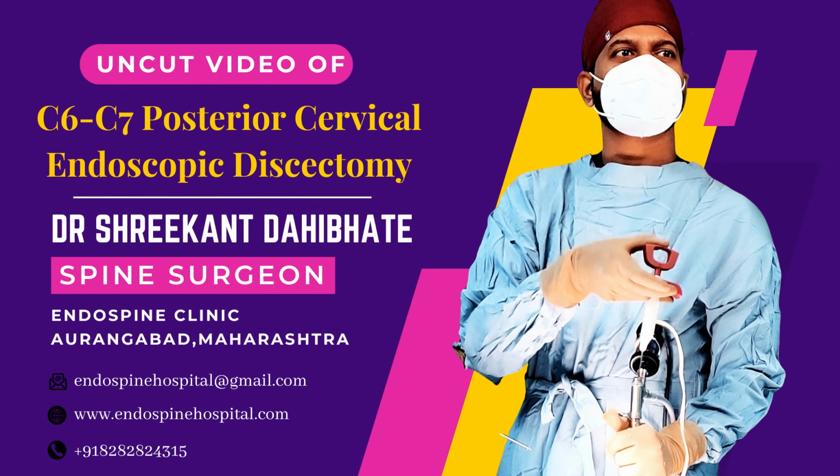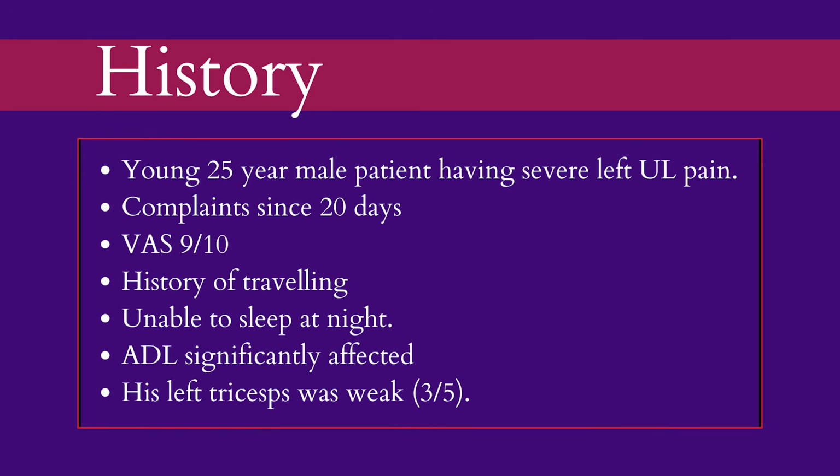Hello everyone. Today we are going to see the uncut video of C6-C7 posterior endoscopic cervical discectomy in a young 25-year-old male patient having left-sided radiculopathy. A young patient, 25-year-old male, having severe left-sided upper limb pain for 20 days. The upper limb VAS score was 9 by 10.